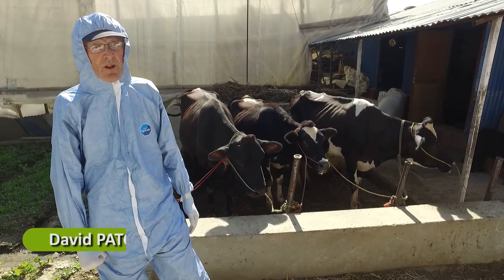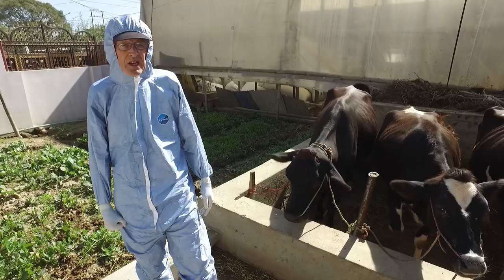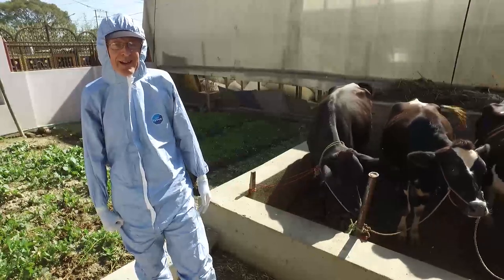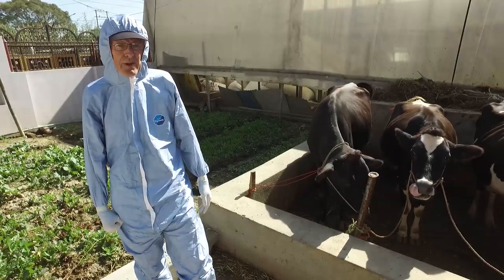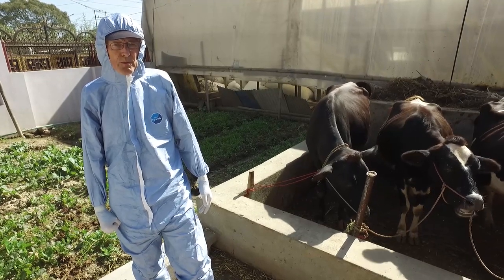Hello, I'm David Pater and I'm working with the European Commission for the control of foot and mouth disease. In this short video I'm going to show you how to collect a probang sample to detect foot and mouth disease virus in the oropharynx of cattle or small ruminants.